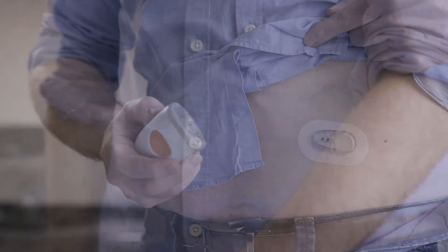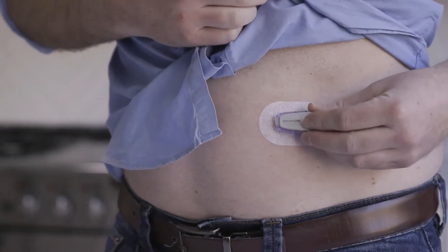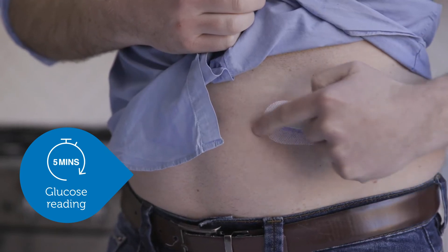Once the sensor is inserted, the transmitter is clicked into place and sends glucose data to your Dexcom One app every five minutes. Your transmitter lasts for up to three months.